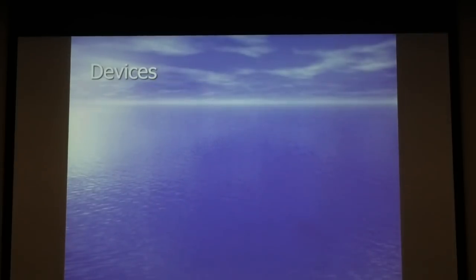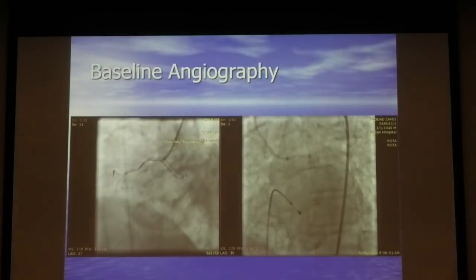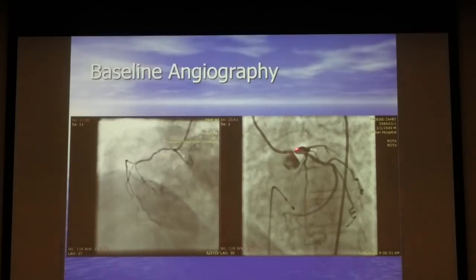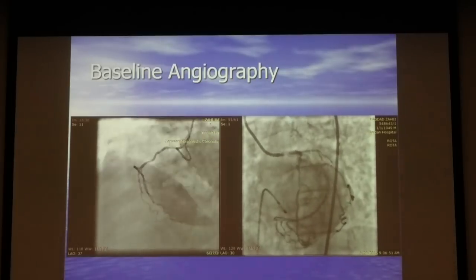You saw that this is really heavily calcified. Left main. Rota. Okay.